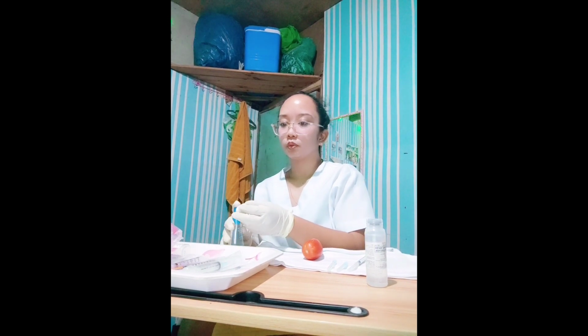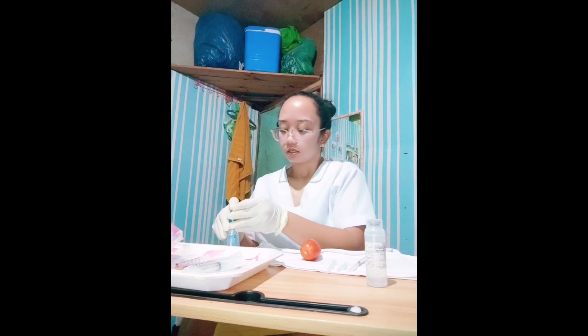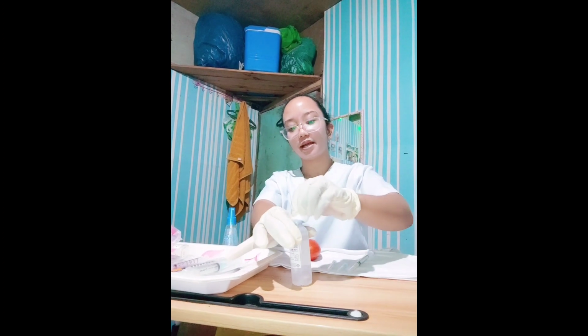We will put our gloves on to avoid contamination. And next, we will clean the site with an antiseptic swab. Start at the center of the site and clean in a widening circle about 5 cm. Allow the area to dry. So we will sanitize the ampoules and the vial.